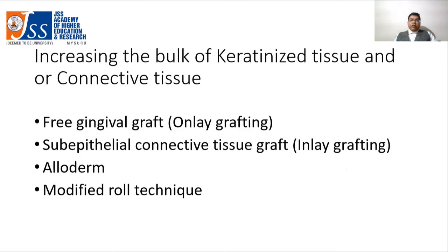We can perform the following procedures to increase the bulk of connective tissue and/or keratinized tissue. Free gingival graft, which can also be considered as onlay grafting. Subepithelial connective tissue graft, which can be considered as inlay grafting, alloderm, and modified roll technique.